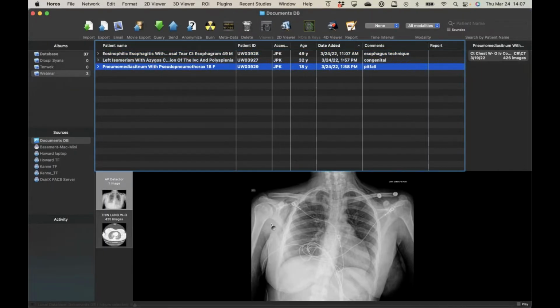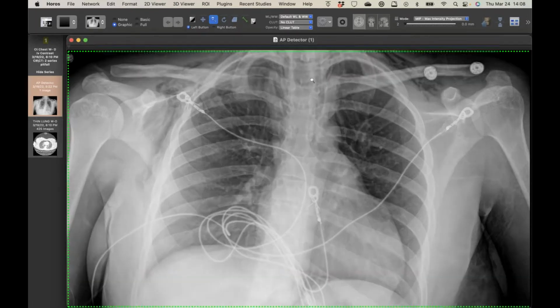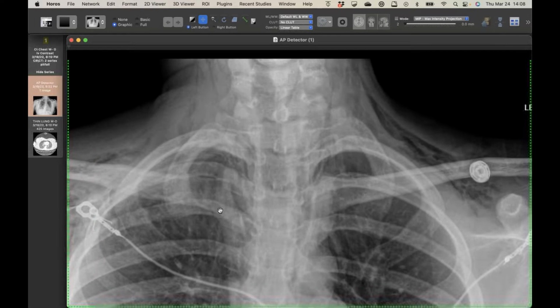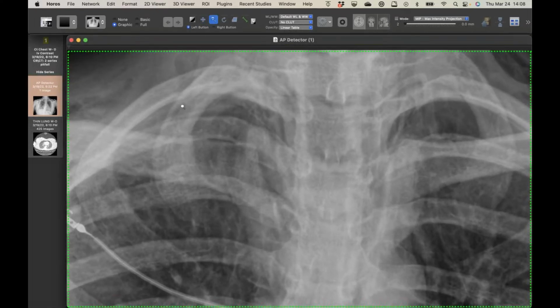All right, and then David will like this last case, because we've talked about this before, and I got fooled on this one. I was suspicious I was going to get fooled, but I couldn't let it go. This patient has pneumomediastinum, subcutaneous gas, and I wondered if this was going to be a pseudopneumothorax or not. But to me, this was pretty convincing that it was going to be real. There's some streakiness out there, but that looks like a pretty good visceral pleural line to me. So I called a small pneumothorax.